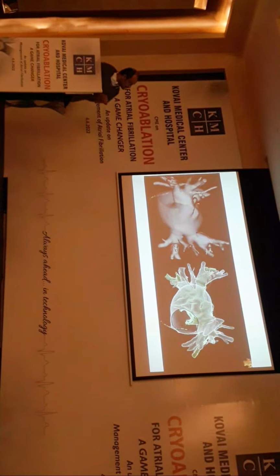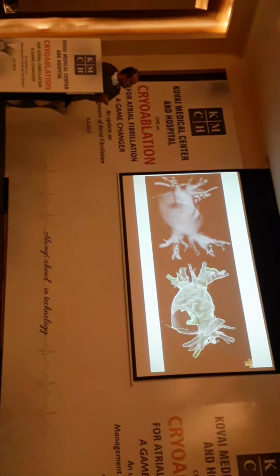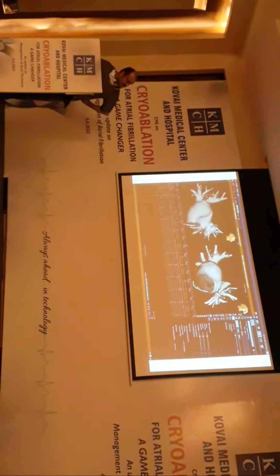So the RAPV, you can see here, is completely signalless. You can see only flat signals here. It's completely isolated. So this is what we did. This catheter is positioned in the branch of a pulmonary vein, and we isolated it, giving a good cryo balloon freeze, and the patient had an excellent isolation post.